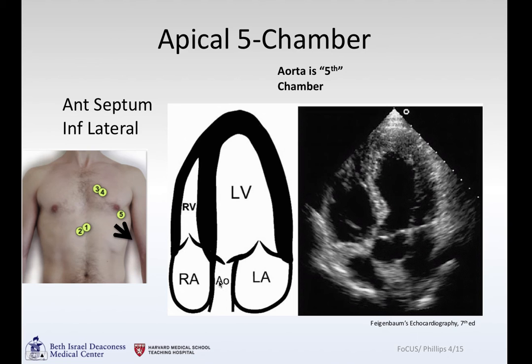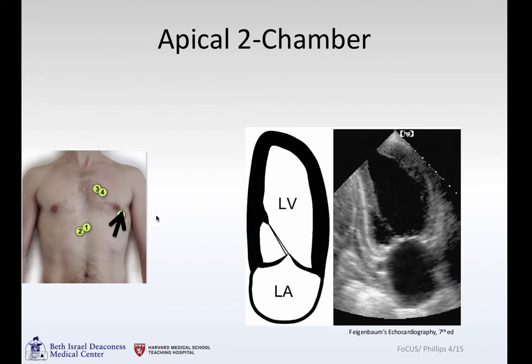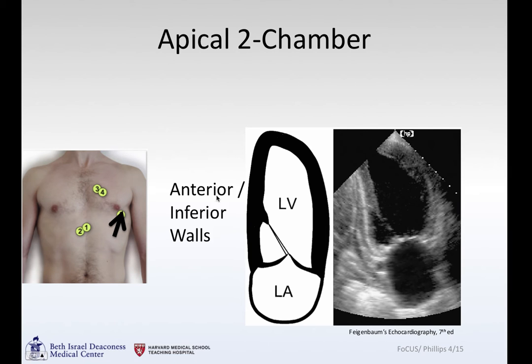Now that the aorta is in view, this is the anterior septum and inferior lateral wall. Once you've rotated out towards the bed and come rotating back across where you were with the apical four, you can get the apical two-chamber view: the inferior wall, anterior wall, and a view of the left atrium and left ventricle.